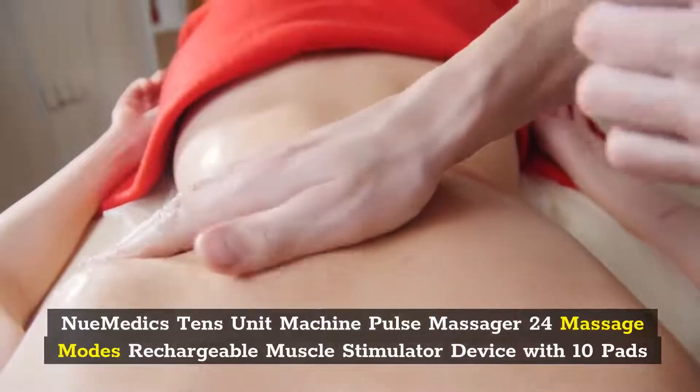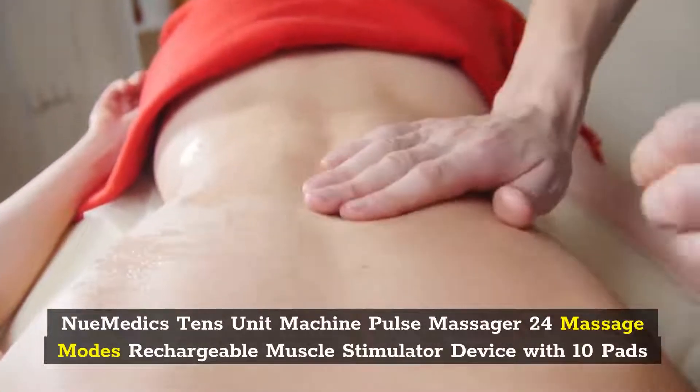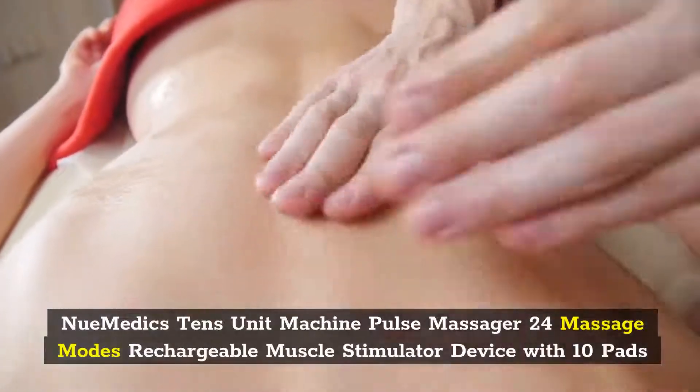Number 5: Pneumetics TENS Unit Machine Pulse Massager, 24 Massage Modes, Rechargeable Muscle Stimulator Device.